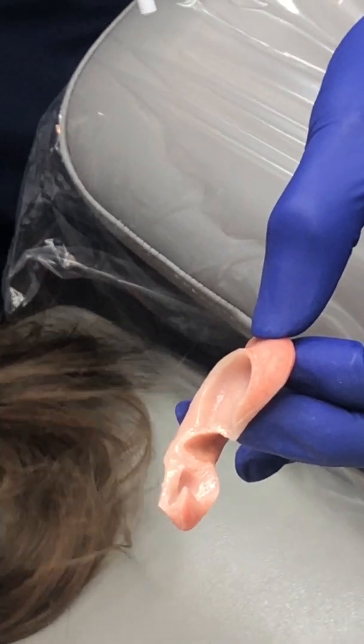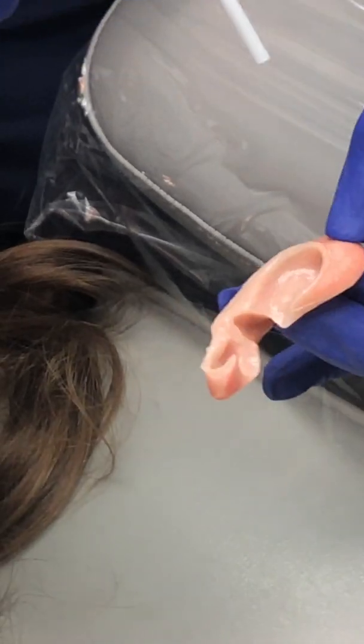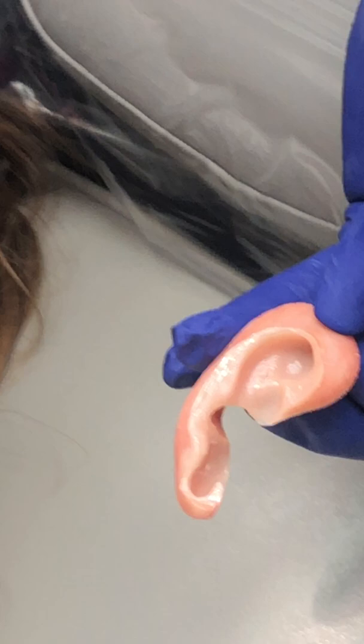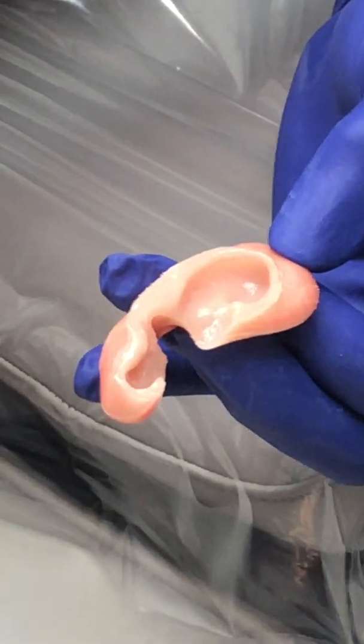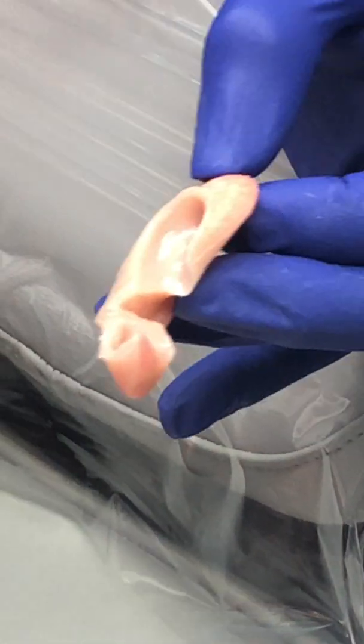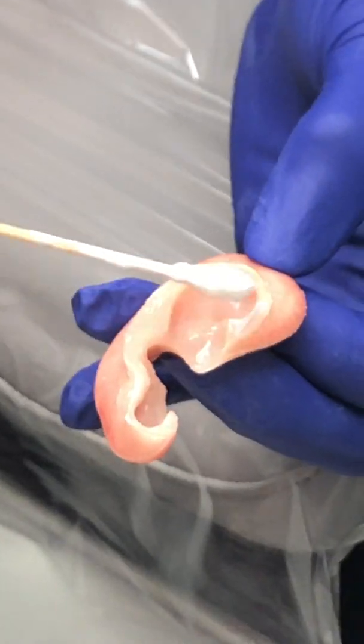More does not mean better. A thin layer of adhesive is what we want. As you can see, it's all gone clear. Now I place the second layer. The second layer of adhesive goes on, and again you'll see it's white.